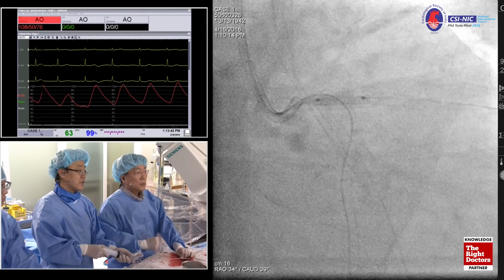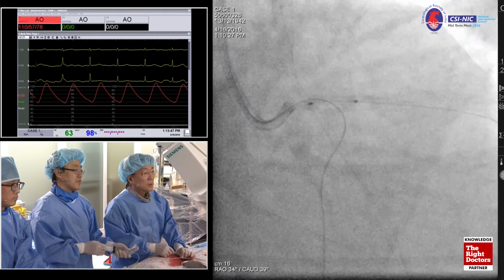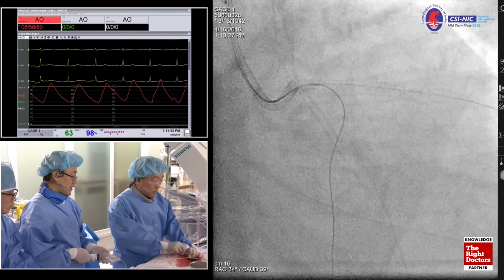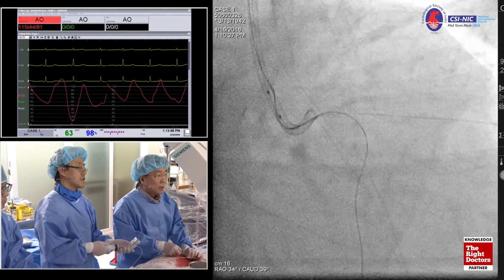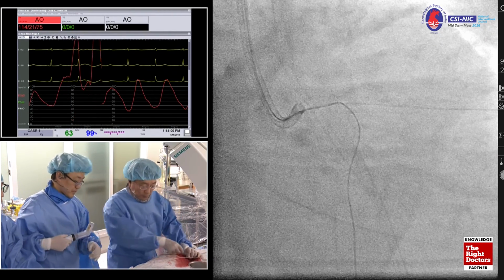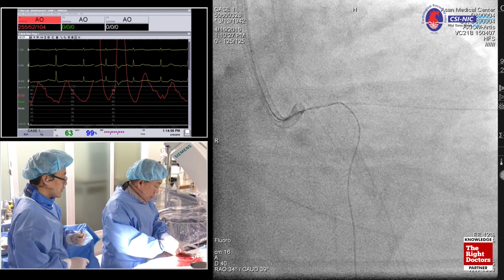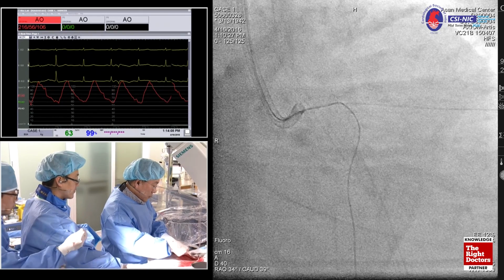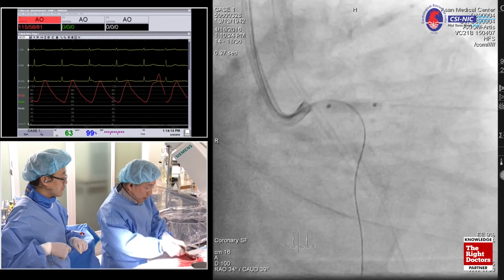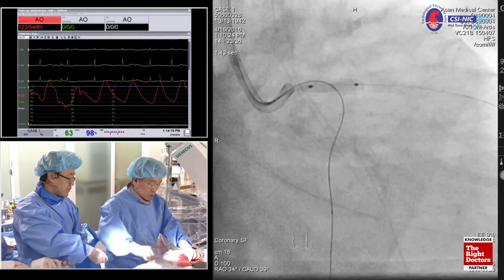There were wires. However, I just do the cutting first. Pull the system out and rotate a little bit more. And all right, so it's not easy. Rotation can make it. Technically, rotating the balloons can cause some kinking of the two wires inside the guide, so we don't do too much.